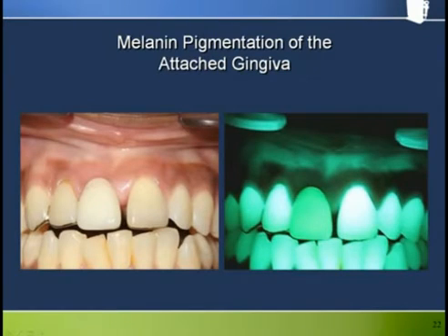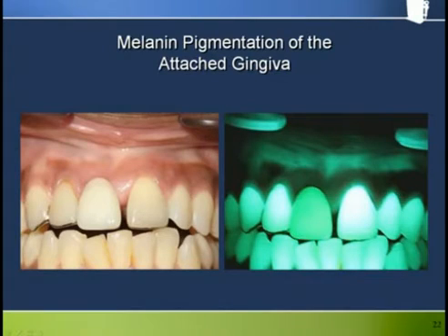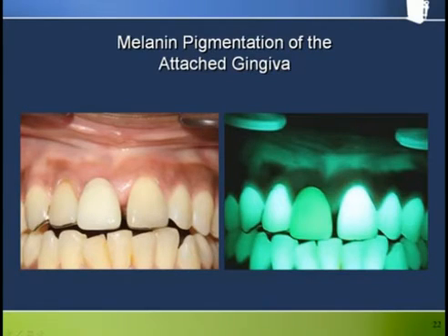Earlier we saw that the attached gingiva typically appear dark under Velscope, although they naturally appear pale pink under white light. Here's another reason they can appear dark under Velscope — in this case it's for the same reason they appear dark under white light: the absorption of light by melanin.